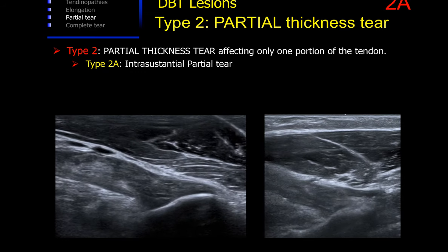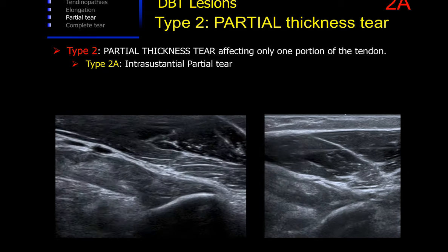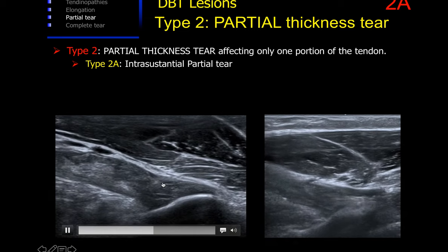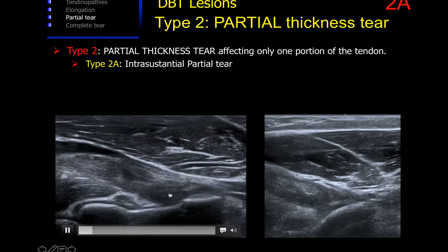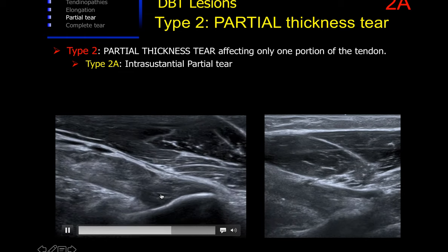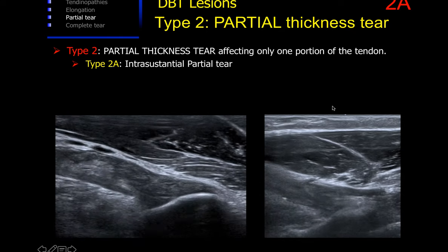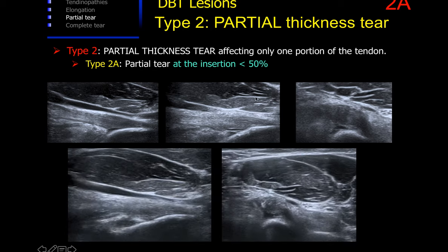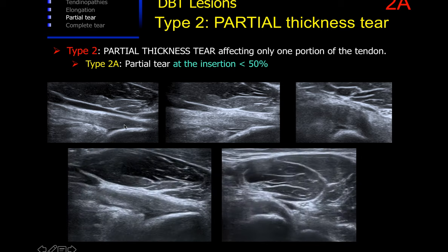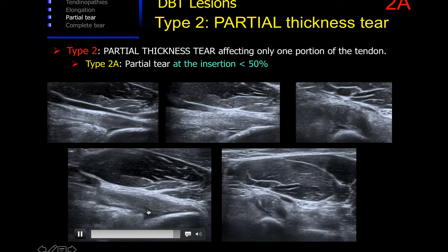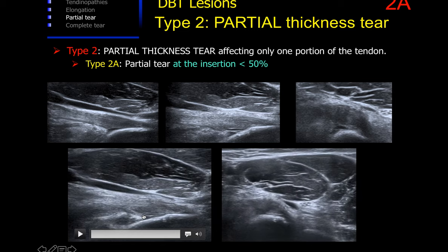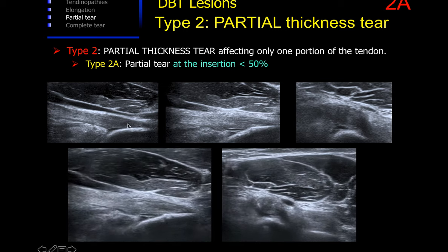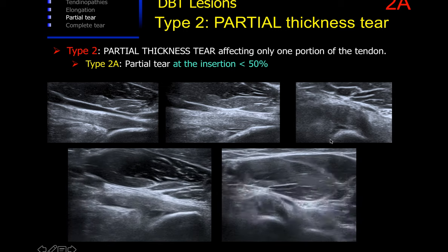We have classified as Type 2a lesions the partial thickness tears that do not affect the total width of the tendon — in this case, intratendinous partial tears that do not affect clearly the insertion. We see holes left inside the tendon while the insertion remains in place. More often, in cases of Type 2a lesions, we see tears affecting the insertion but less than 50% of the entire insertion at the radial tuberosity. We can see the cleft, the rupture at the insertion, but more than 50% of the tendon remaining.